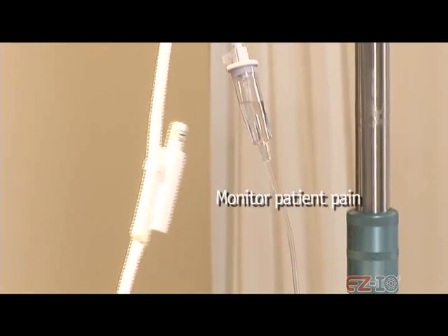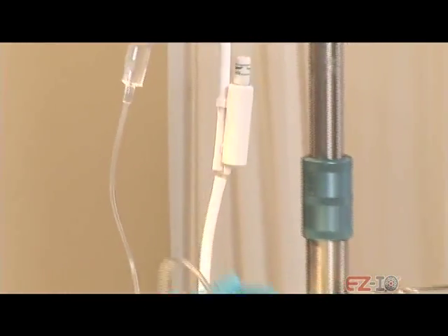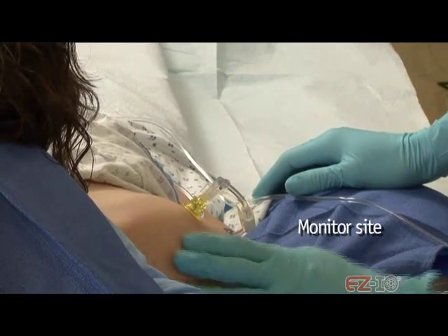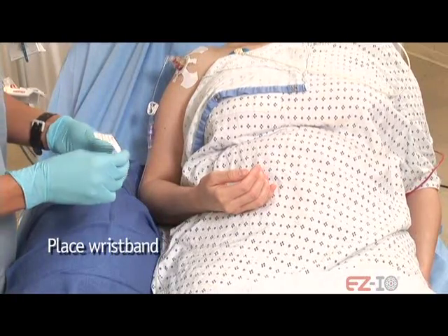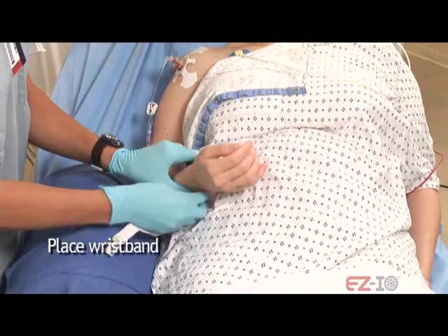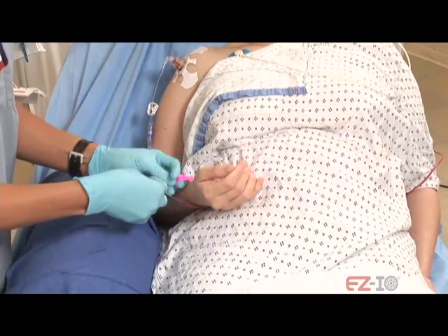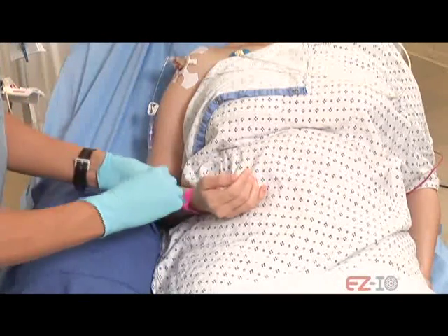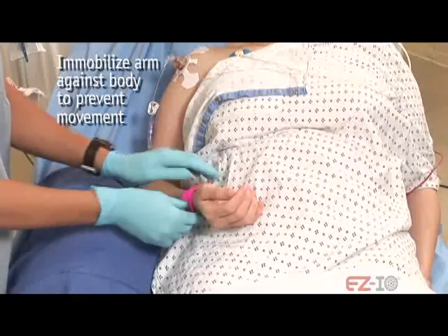Monitor the patient's pain during infusion and repeat lidocaine as necessary. Monitor the infusion site for signs of extravasation. So now that we've got that in, I just need to put a wristband on you — this identifies to everyone else in the hospital that you have an IO in place. Place the wristband on the patient indicating the date and time of EZ-IO placement. That's it, and we're done.